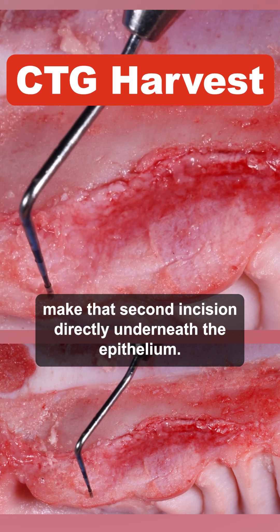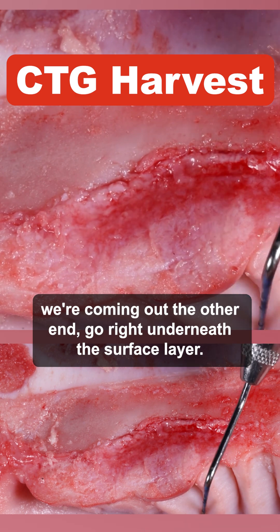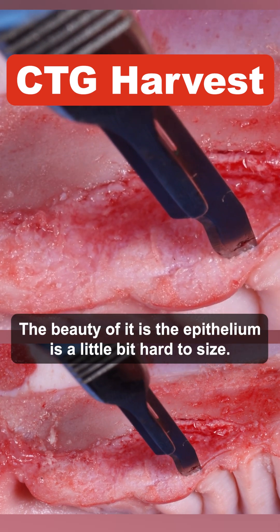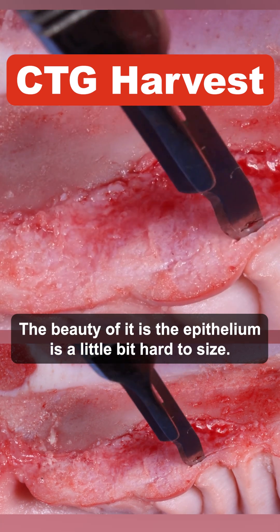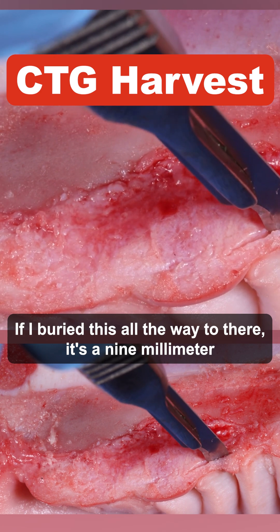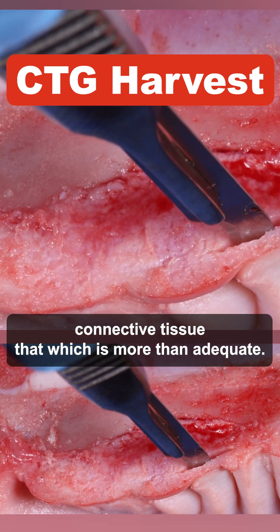Make that second incision directly underneath the epithelium — but if we did that here, we'd come out the other end. Go right underneath the surface layer. The beauty of it is the epithelium is a little bit harder to incise, so you can go by tactile sense. If I bury this all the way to there, that's a nine millimeter connective tissue graft, which is more than adequate.